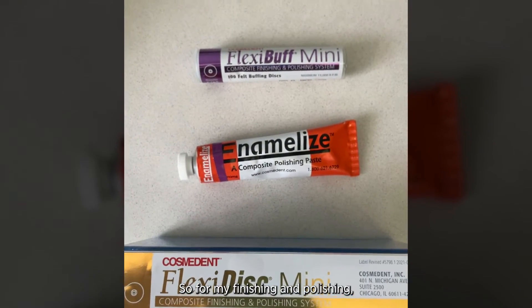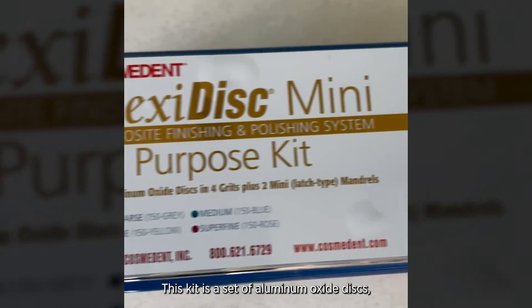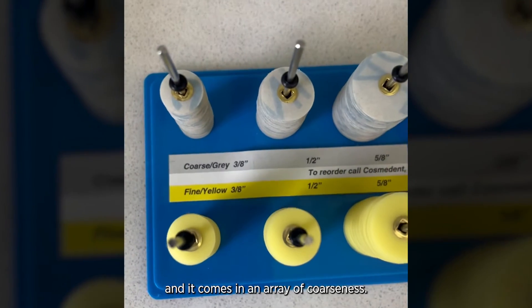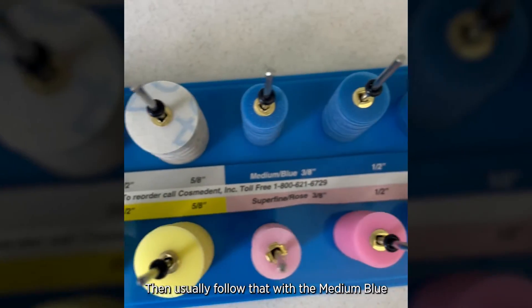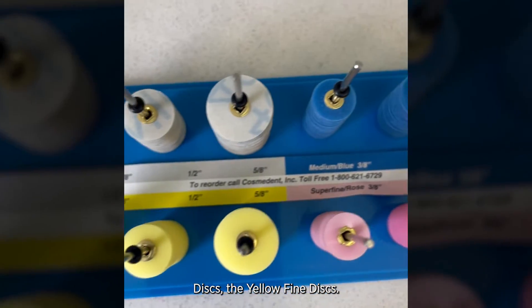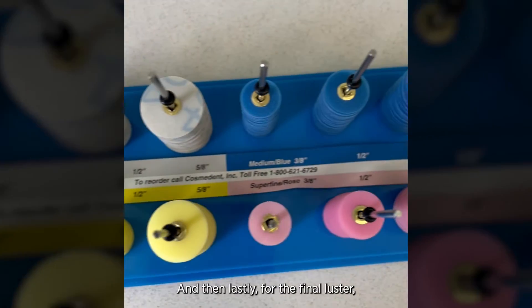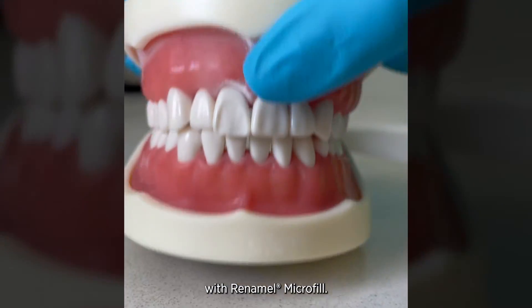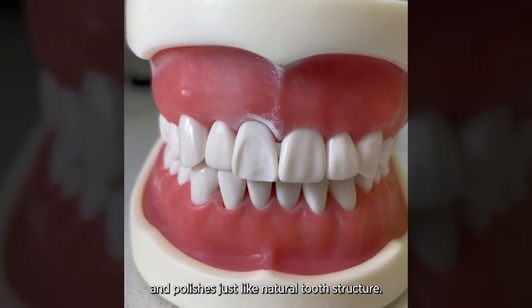For my finishing and polishing, I'll be using the Cosmedent FlexiDisc mini kit. This kit is a set of aluminum oxide discs and it comes in an array of coarseness. We have the coarse gray disc to start, then the medium blue discs, the yellow fine discs, and lastly for that final luster, the pink superfine disc. I'll be restoring number 8 with Renamel Microfill — it really holds its polish and polishes just like natural tooth structure.